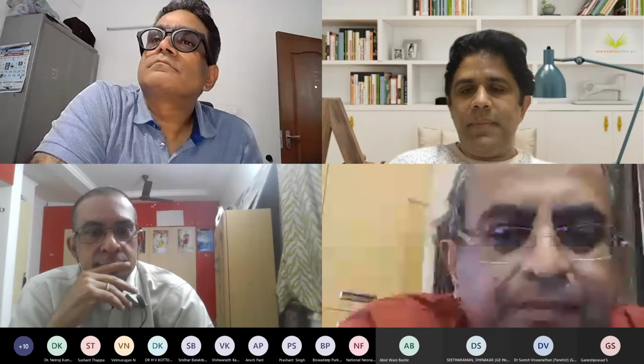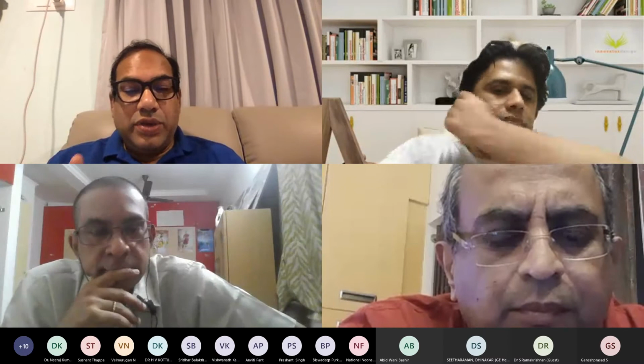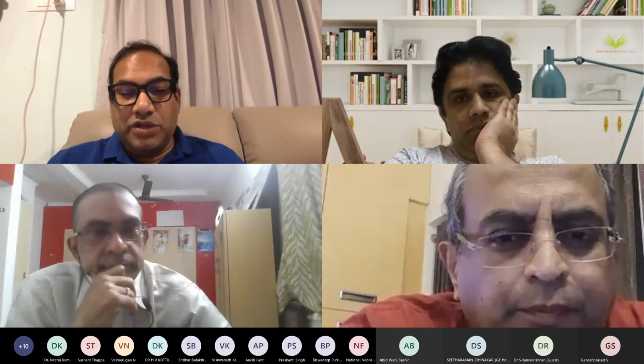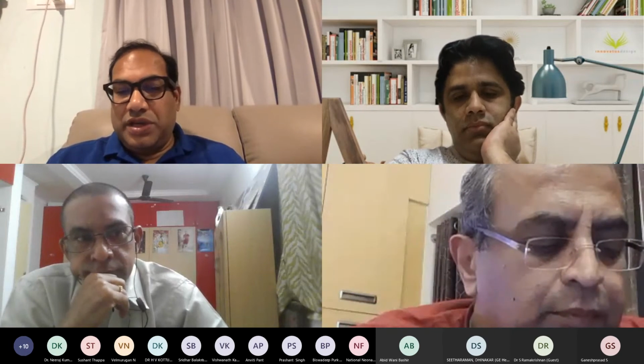Dr. Suresh. Yeah, thank you. Two things. One is most companies will give you a demo which allows you to hold on to the monitor for several days, so that you can actually develop a personal comfort. So before buying or deciding on any monitor, please ask for a demo that you can use with your patients. If you're starting a new hospital, you're in the initial procurement and you don't have admissions yet, it might not be feasible, but do try to test out all the monitors and see what you're comfortable with.